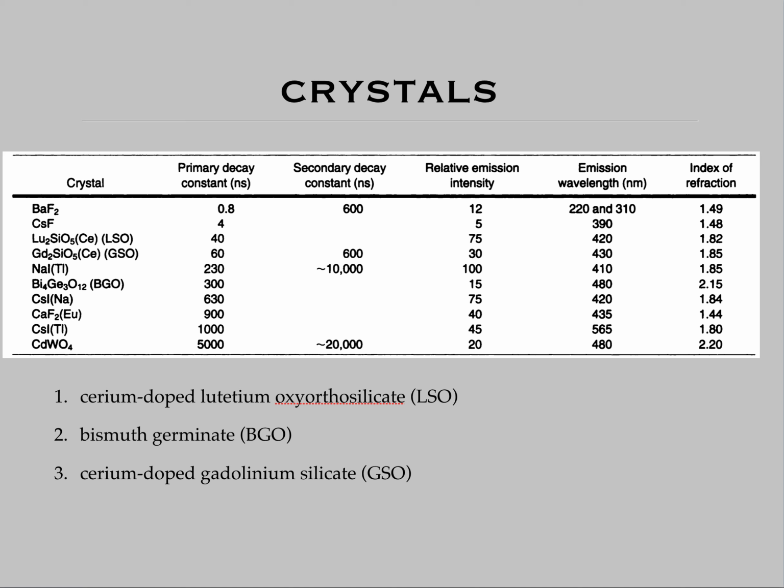Crystals, like every other technology, there has been evolution in the crystals, and they have gotten better. For the purposes of this talk, you should just be aware that crystals exist, they're important, and be familiar that at least there are names like LSO, BGO, and GSO out there.